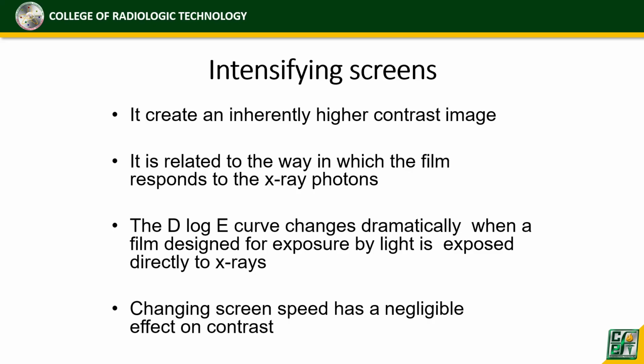So, kapag ang gamit natin ay tamang intensifying screen, di ba, meron tayong tinatawag na film screen combination. Di ba? So, we only use the correct film sa specific na film screen or IS.